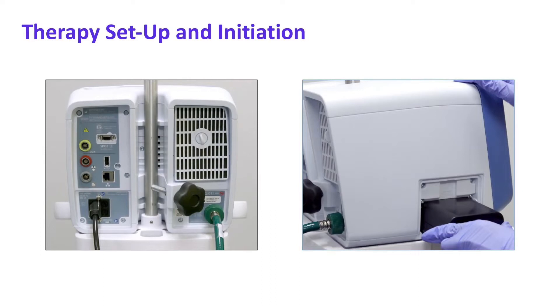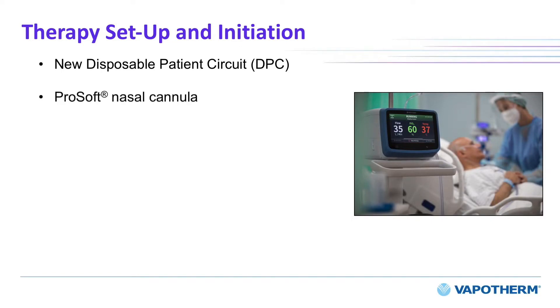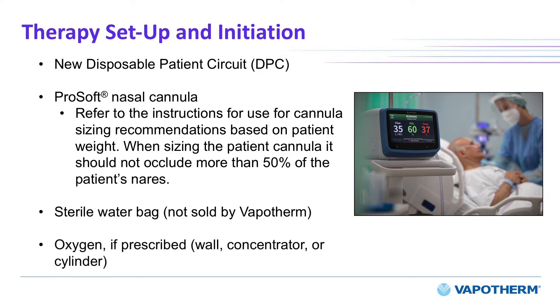With the HVT 2.0 system fully assembled with an adequate power supply, either through the wall outlet or optional transfer battery, therapy setup will require the following components: a new disposable patient circuit, ProSoft nasal cannula — the instructions for use will provide recommendations to help determine the proper cannula sizing for each patient — a sterile water bag, and oxygen if prescribed.